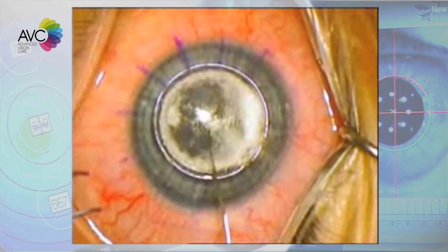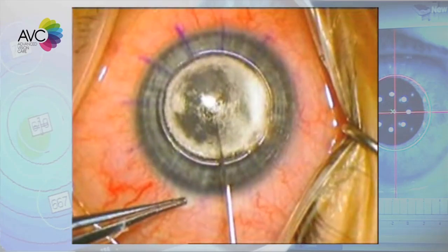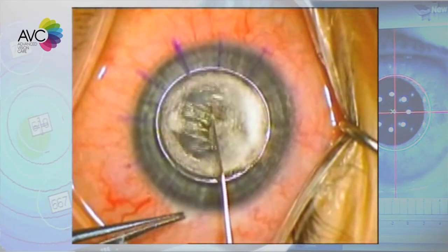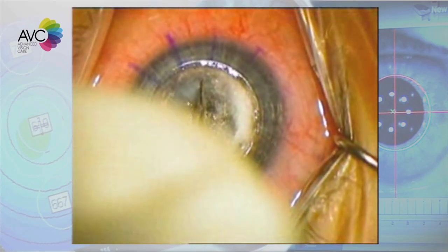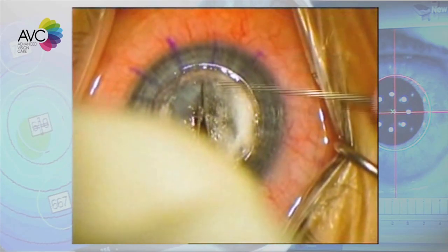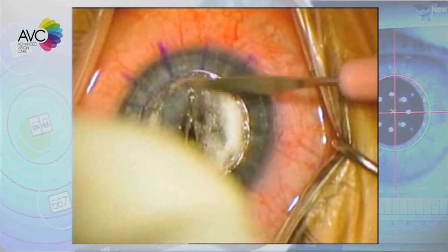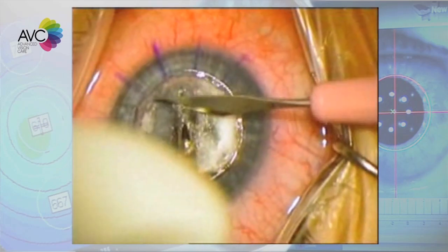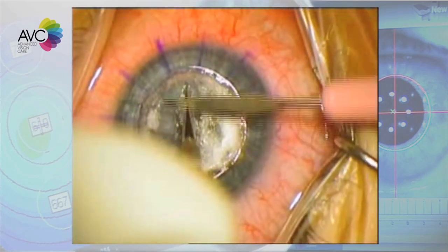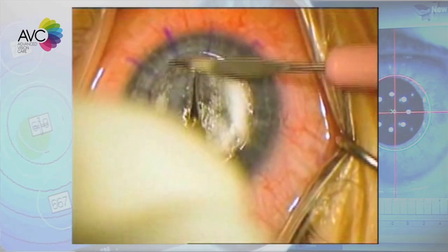So now we are removing the stroma. And we know that our Descemet membrane is detached, so we are penetrating the deep layers of stroma. And now we are just cutting the remnants of the stroma. And you will see after a while there is just a clean Descemet membrane of the patient.